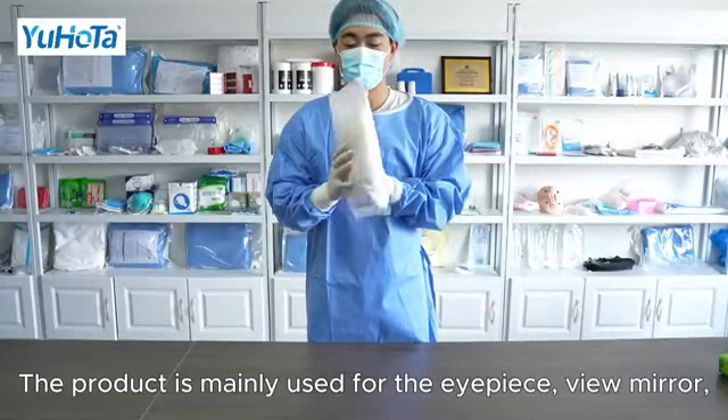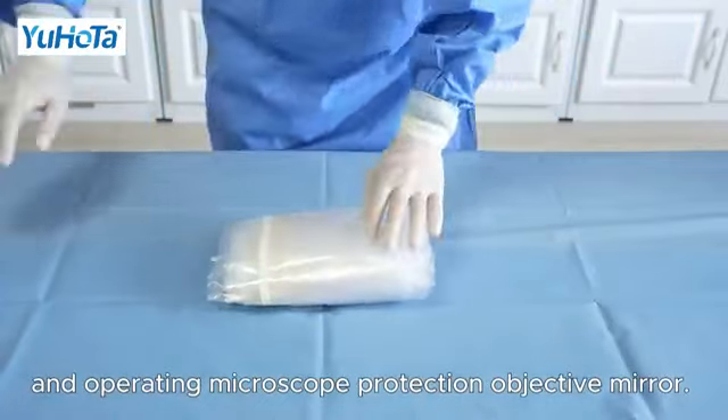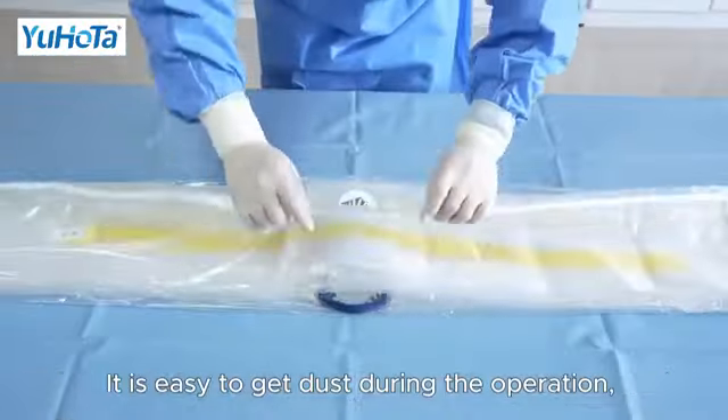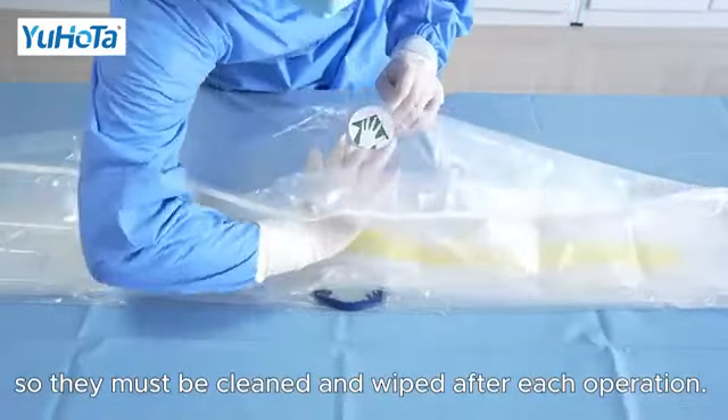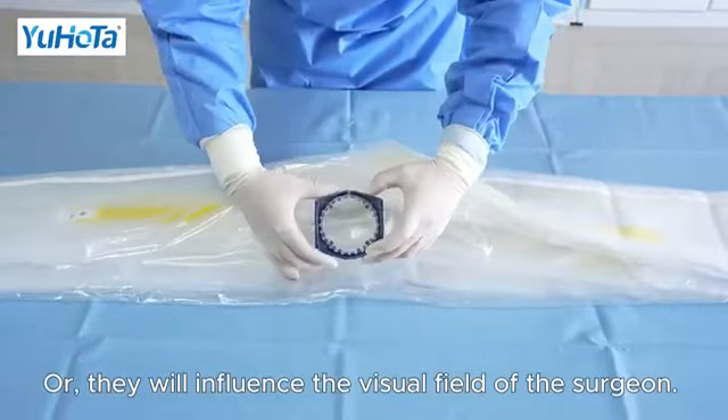The product is mainly used for the eyepiece, view mirror, and operating microscope protection and objective mirror. It is easy to get dust during the operation, so they must be cleaned and wiped after each operation, or they will influence the visual field of the surgeon.